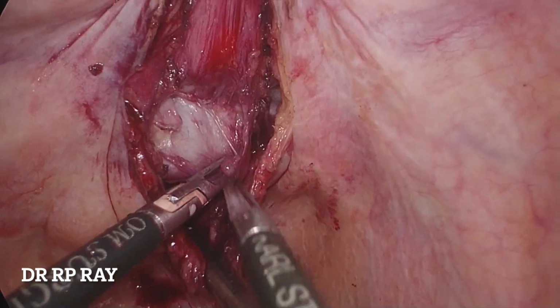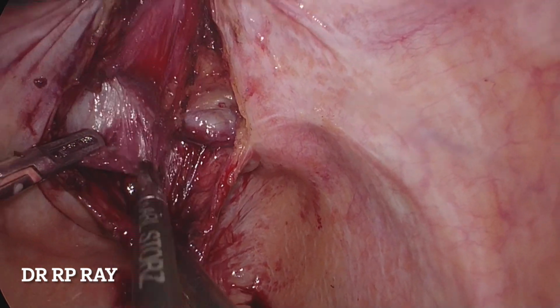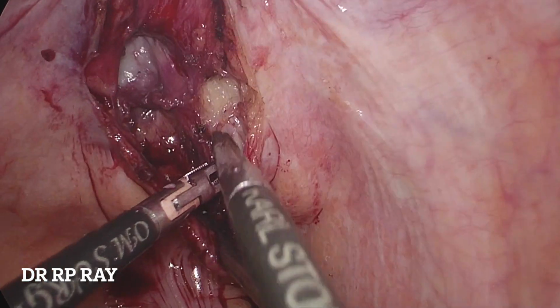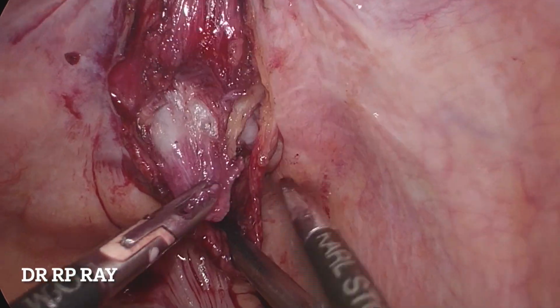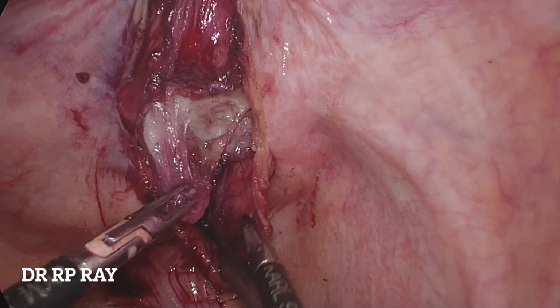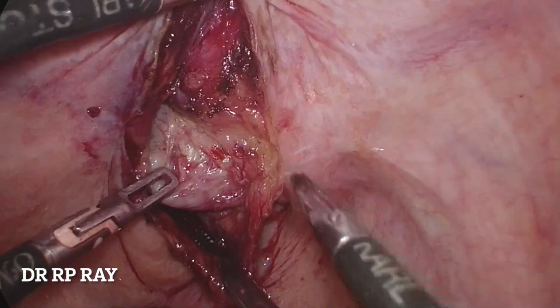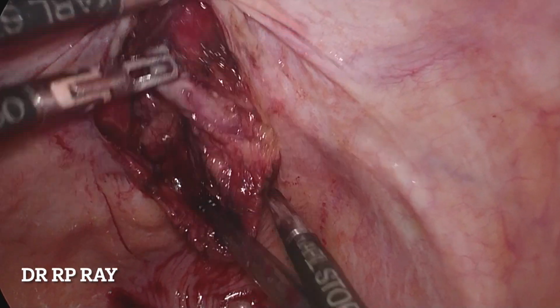So this is on the left side vas deferens. You can see this is the right vas. Fascial attachments are teased out, progressively separated, and identify the structures very well. You continue slow dissection, and all these surrounding fascial or fibrofatty tissue are separated. Now you can identify this is the right vas deferens.